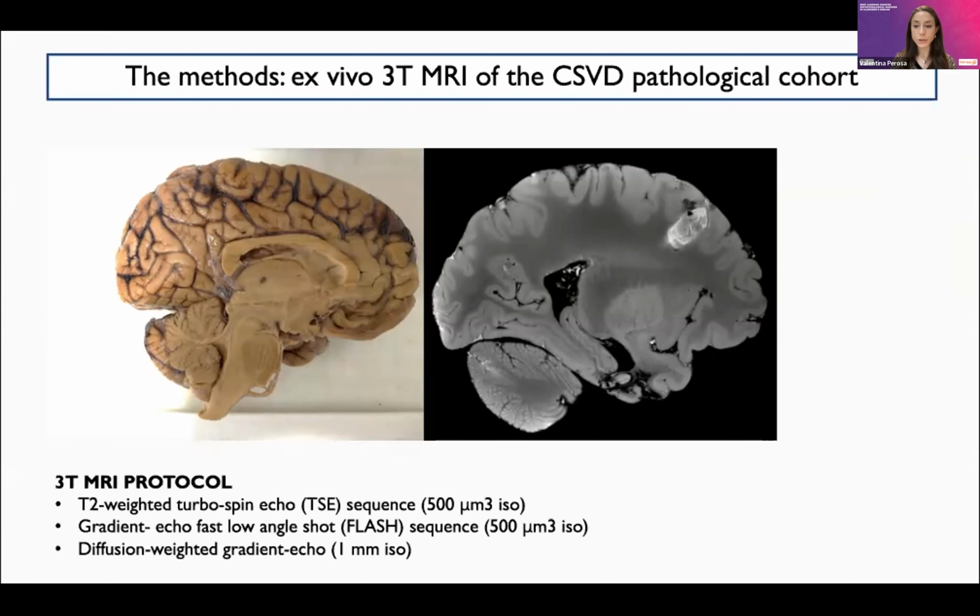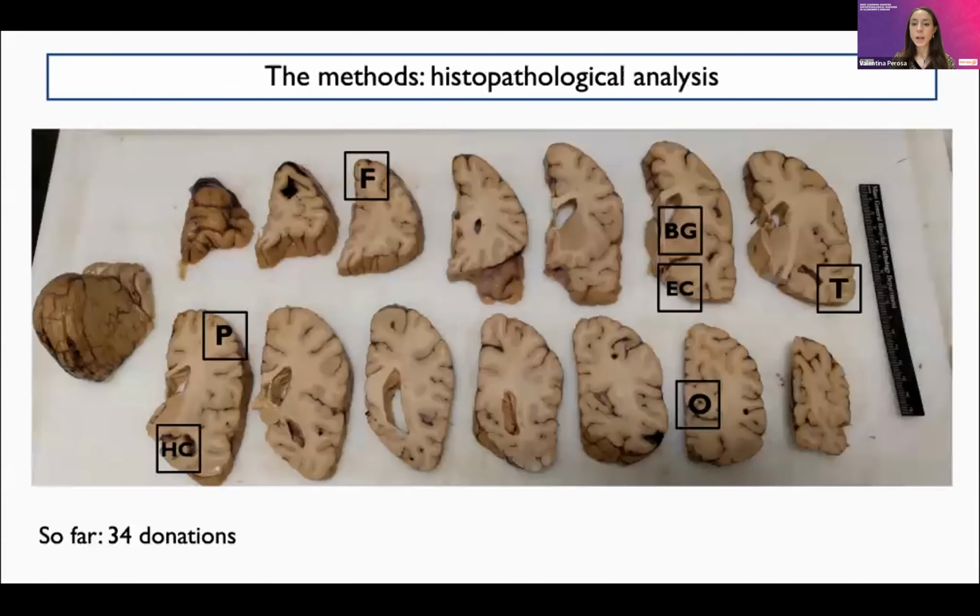And the protocol includes a T2-weighted turbo spin echo, but also a FLASH sequence and a diffusion weighted sequence.